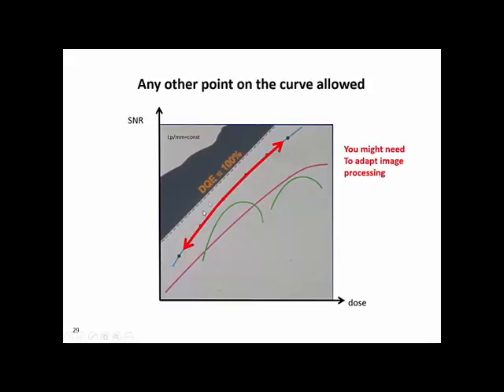Pediatric questions could be located down here, follow-up studies as well, where a higher noise level could be tolerated, and a higher dose could be required if very, very fine and very super sharp structures need to be seen. So one system in one room could supply different dose levels depending on the question. This is possible in DR, which is a big benefit and a big degree of freedom, but it also gives the responsibility to the customer for what to do about dose.